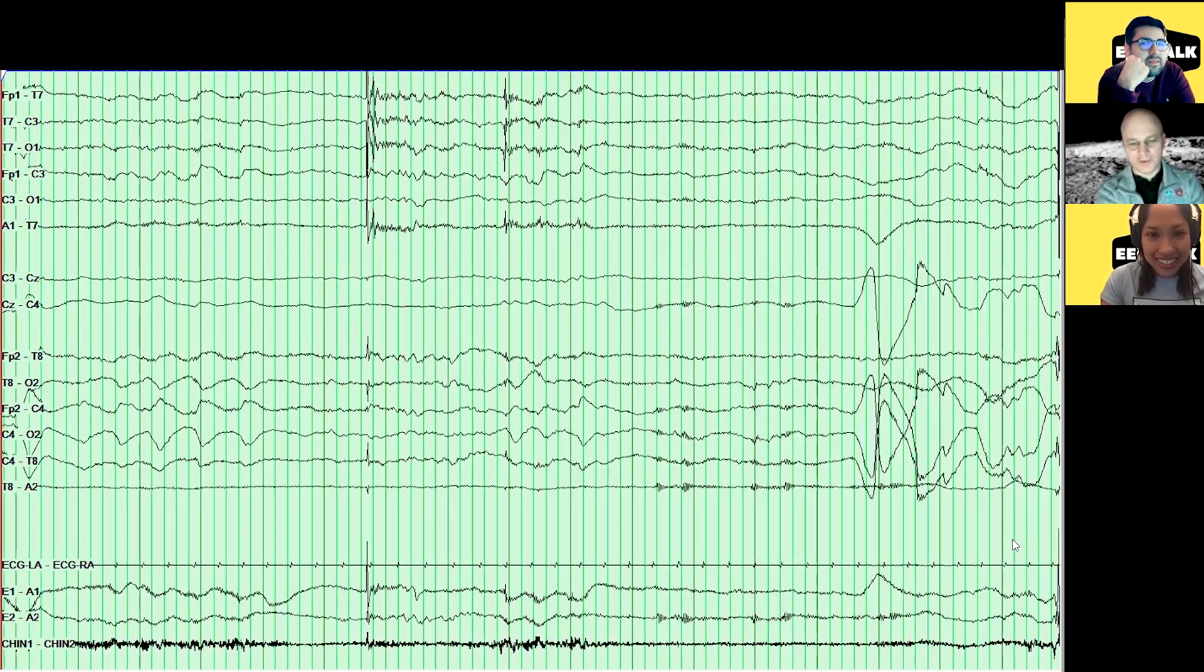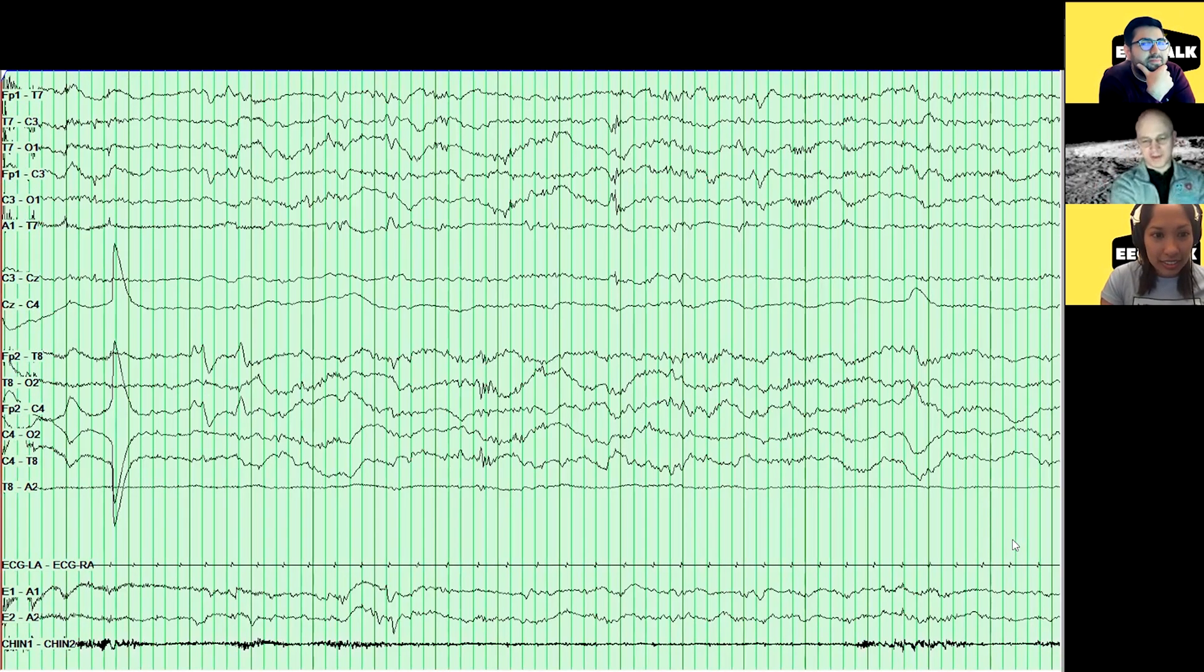Can I ask, so when do you... So there's predominantly delta here. And when do you expect to see predominantly theta? And then when do you see, you know, no slowing? Oh, I see. So essentially, we start to see something that approximates an anterior posterior gradient with a posterior dominant rhythm around three months. I think that's when, you know, you start to comment on a PDR, if you see one or not. Before two or three months, we generally don't comment on it.